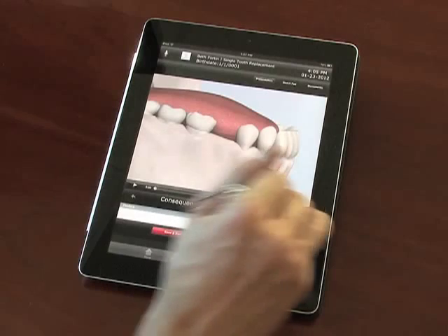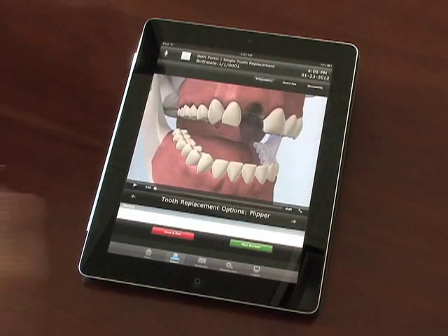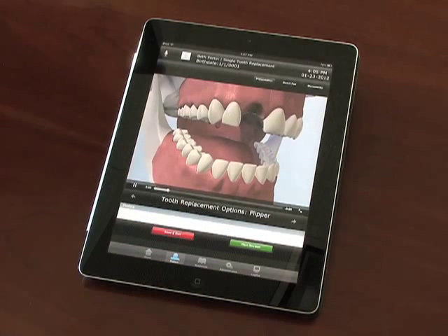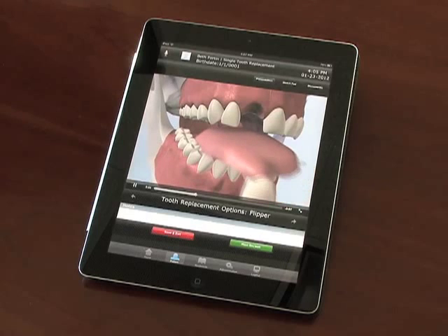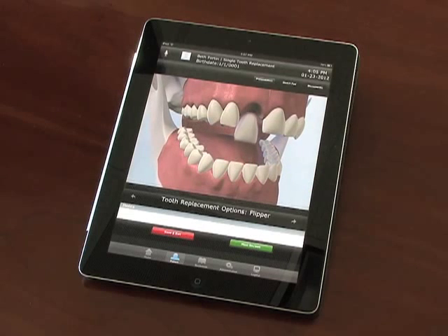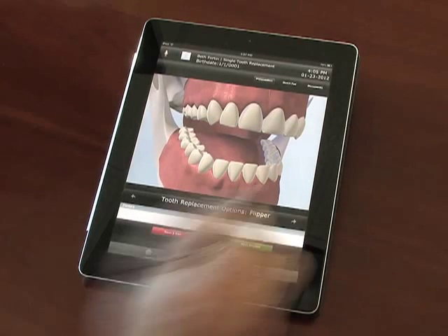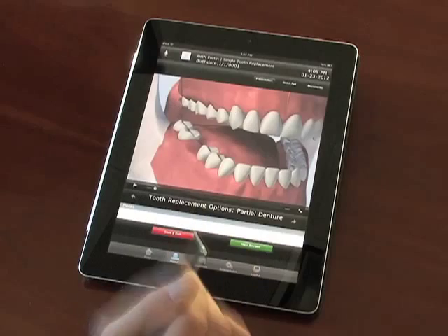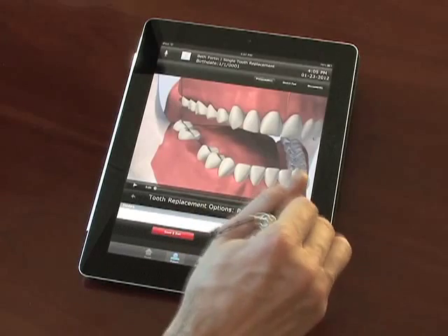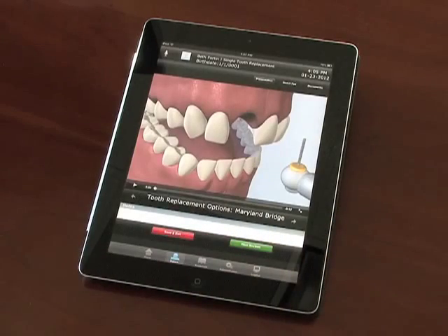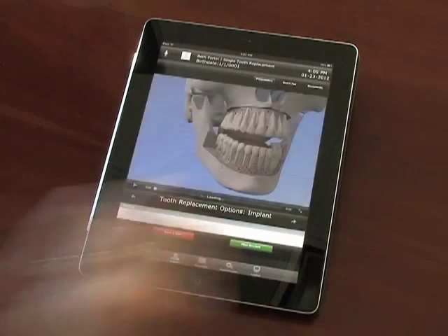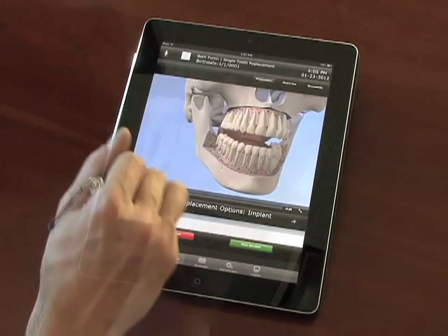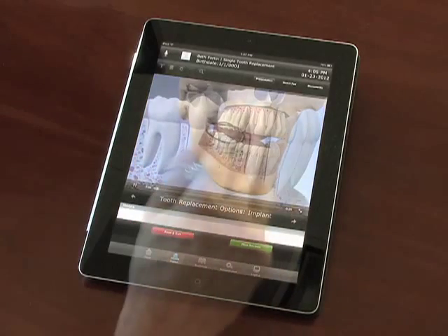Jump back to the presentation at any time to resume from where you left off. EyeConsult is built so that you can bypass the screens that are not relevant to the patient's condition, making it easy to personalize the experience and presented content for the patient's unique situation.